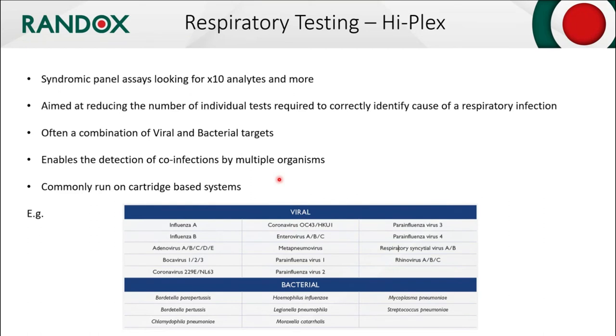So these types of assays obviously pose a problem for QC. You've got a lot of analytes here and they all need to be quality controlled ideally. And there are different regimens that you can implement to ensure that you're doing this. But one of the biggest problems we see is that it's very difficult to actually combine all of the analytes into a single vial. If you do this with whole pathogens, you'll find that there's competition, there's dilution effects, and ultimately not all the analytes will recover on all the machines that are on the market. It's just not possible. We do find that some providers will use plasmids and vectors. They'll insert genetic material into the controls, spike it in there to ensure that it's at high levels. That's not something at Randox and Qnostics we're keen on doing.